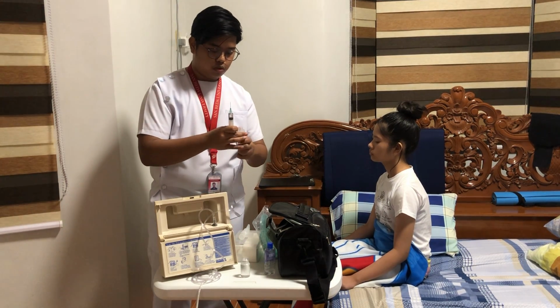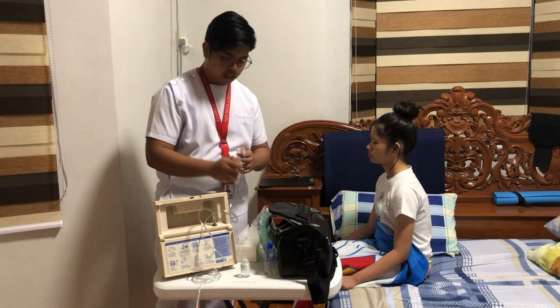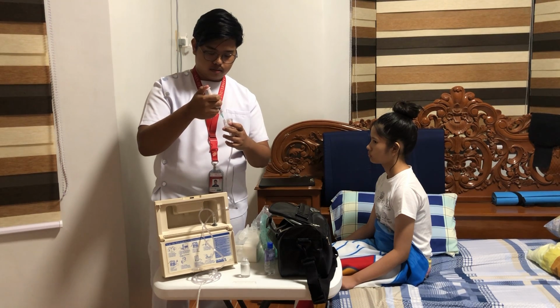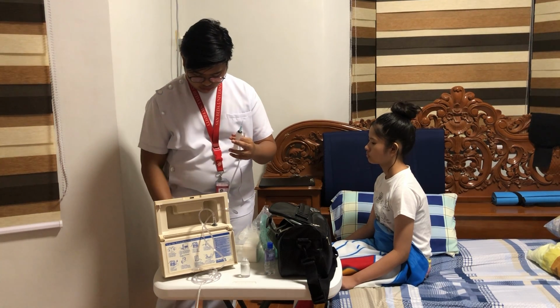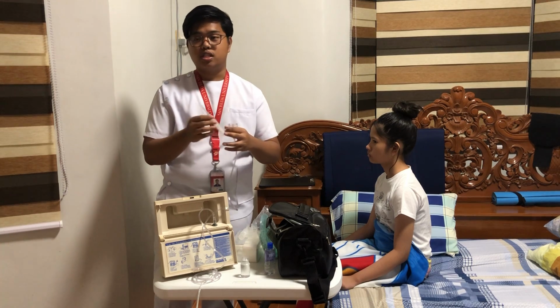And then we're going to open the chamber cup and then place the solution. And then after that, we need to discard.